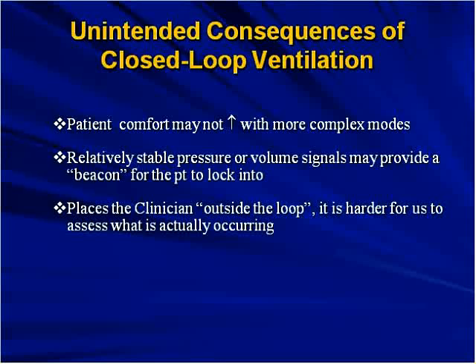One of the major problems is with high levels of pressure support, depending on your flow termination criteria. High levels of pressure support increase the inspiratory time. A long pressure rise time increases inspiratory time, and so does a slow flow termination criteria. So all three of those things can cause air trapping. And paradoxically, we don't really want to give patients with COPD large tidal volumes, the same as we don't want to give them with ARDS, but for different reasons.